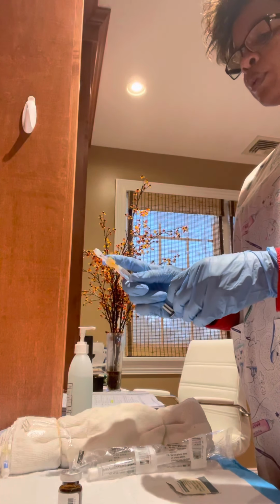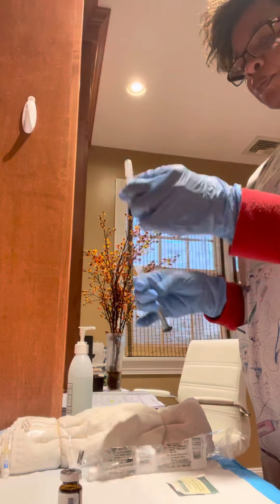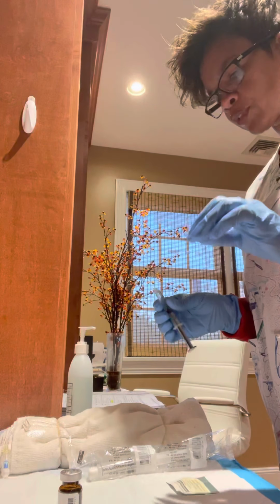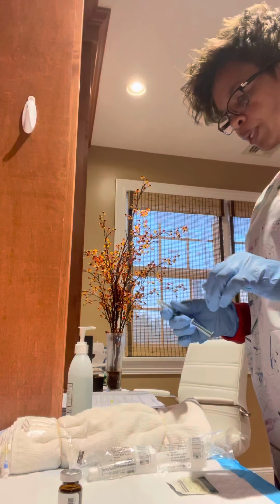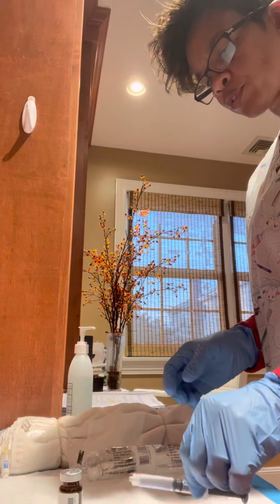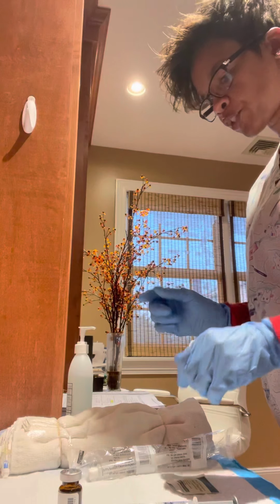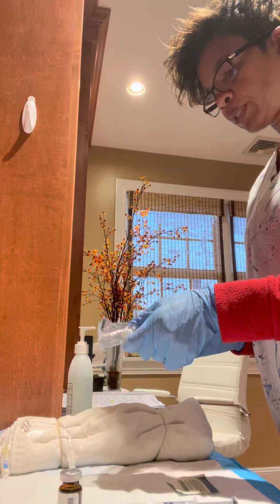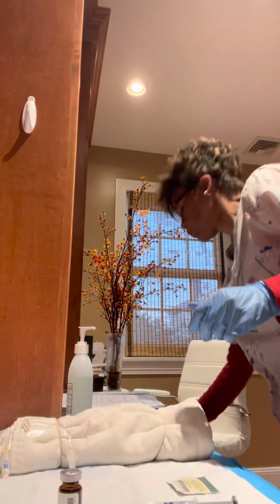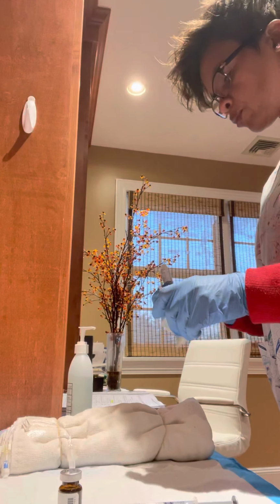So I'm just going to do the safety and then get rid of the needle in my readily accessible sharps container. And then what I'm going to do, because I have a clean surface, and I'll just put that right there, because we need to flush the IV with the 3 ml. So I'll get ready. So I get the saline.